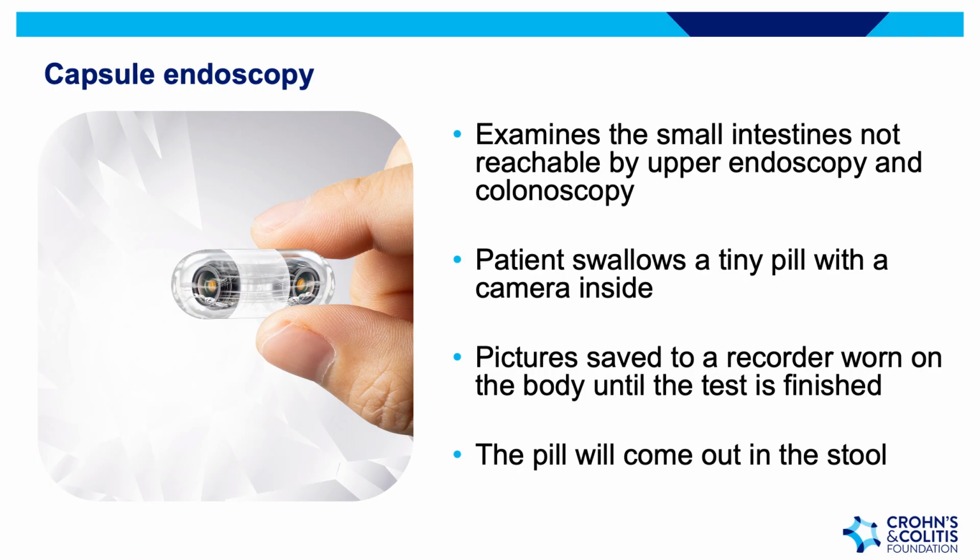The pill, in usually a day or two, will come out in the stool. It does not need to be retrieved because the images have already been saved and returned to the doctor for processing.